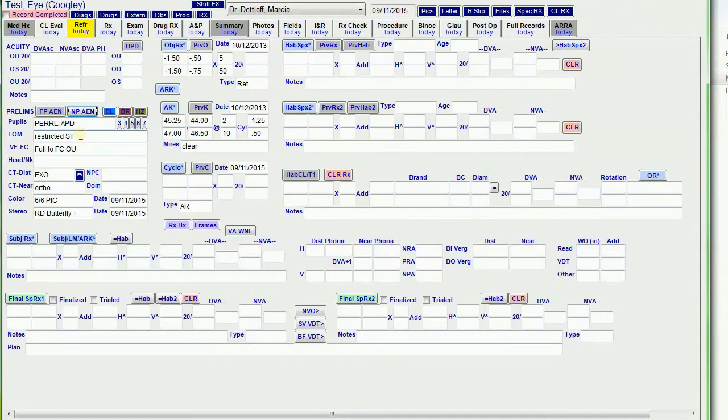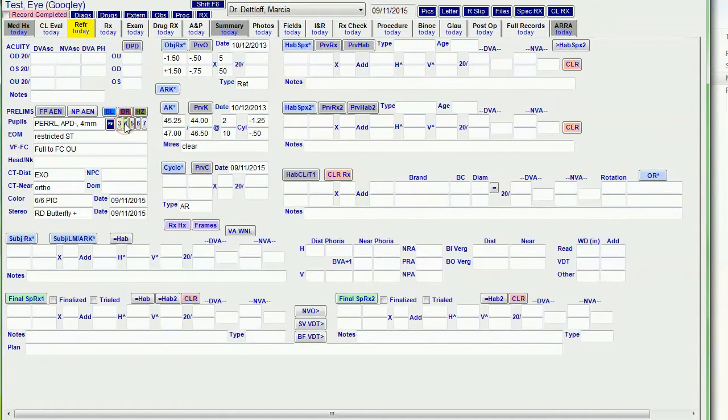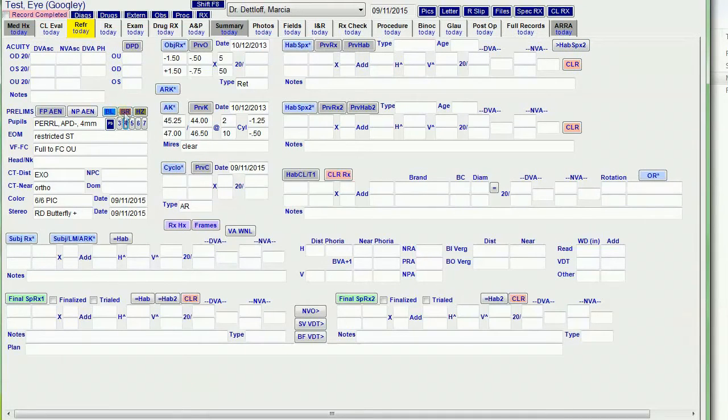And it enters the current date in there. I can append the pupil size to the pupil information, and I can click blue, brown, or hazel to put the iris color in the exam field.